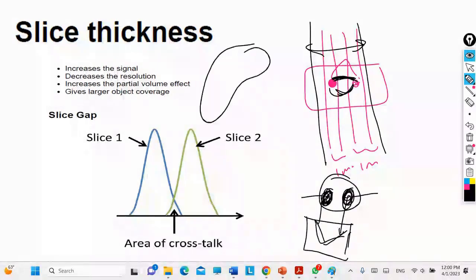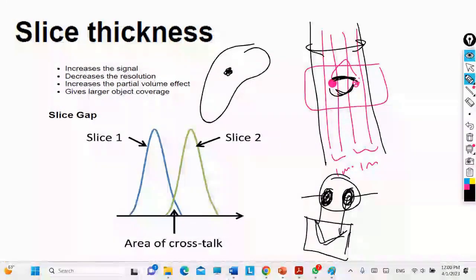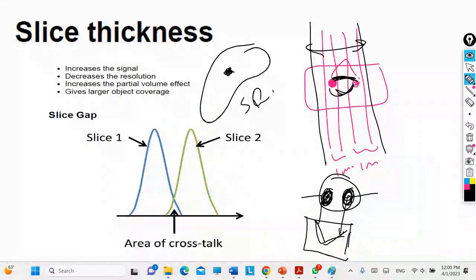For example, when you look at a liver image you might see a part that looks like a focal lesion — a gray shadow or hypo-intensity — that makes you question what it is. You reduce the slice thickness and check, but the finding is only visible in one slice and not repeated in several slices. That tells you: this is partial volume.